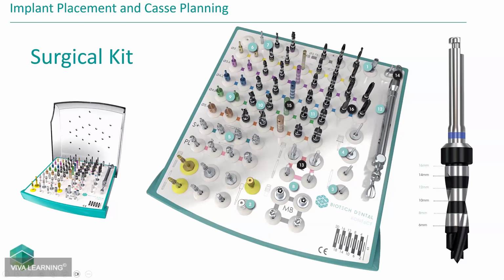You have a surgical kit that you walk through, and it's really hard to illustrate that right now, but as you work with your rep or whatever implant system you decide to use, they'll walk you through your kit. It's almost like an algorithm. It's like, you go here, you go there. What's my width? Here we go there. And you move your way down.